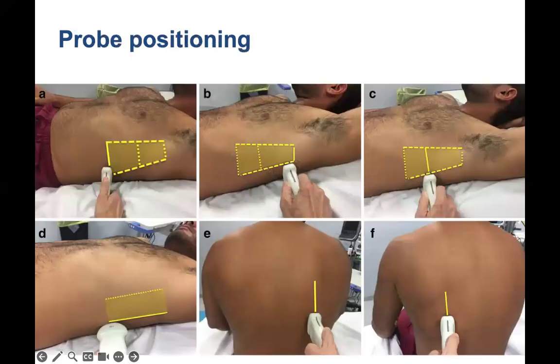When we want to find that probe positioning, I generally am in the position here in D. So again, I'm in that posterior axillary point, really posterior, almost parallel with the bed, indicator towards the patient's head. But they show A, B, and C to show how it's important to find that diaphragm. In this scanning technique, they start with the probe indicator oriented this way, and they scan up and down this way to find that area where they see the diaphragm. And then once they find it, they rotate so that the indicator is now towards the head, or cephalad.